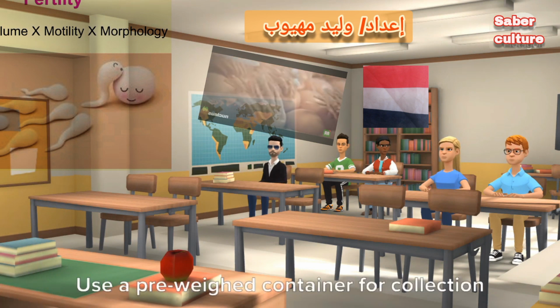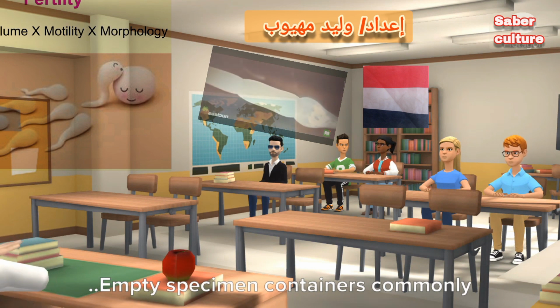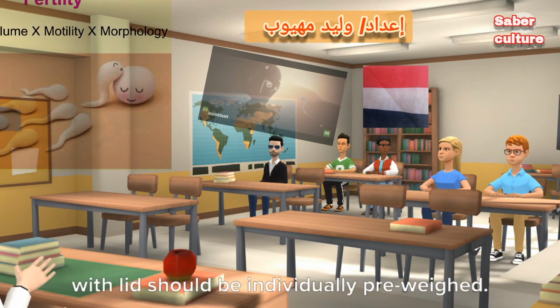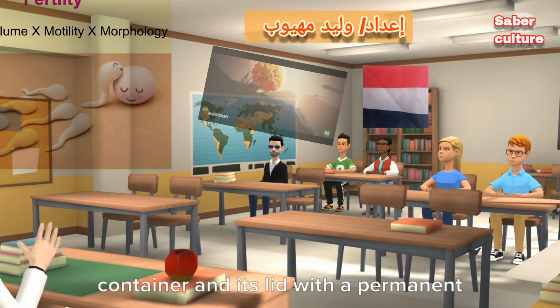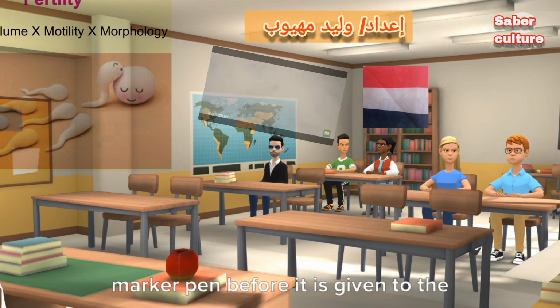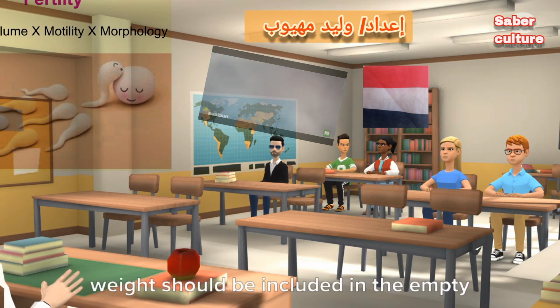1. Use a pre-weighed container for collection of the ejaculate, with the weight noted on the container and lid. Empty specimen containers commonly have different weights, so each container with lid should be individually pre-weighed. The weight should be recorded on the container and its lid with a permanent marker pen before it is given to the patient. If labels are used, for example, for identity markers, their weight should be included in the empty weight. Sterile containers should not, and do not, require opening for this.